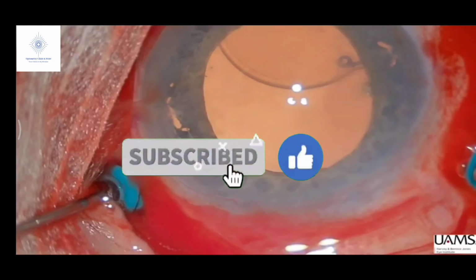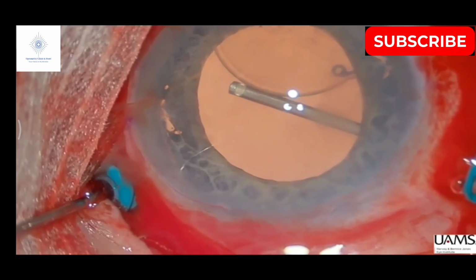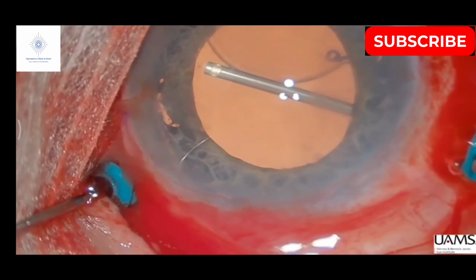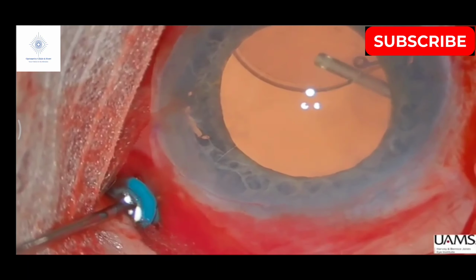In this case, the iris-sutured IOL is partially displaced. Other indications for iris-fixed IOL removal include chronic iritis, recurrent hyphema, or cystoid macular edema. Here we've opened the conjunctiva and set up 3-port vitrectomy. We remove the anterior hyaloid and do pars plana vitrectomy to prepare for lens removal and exchange.